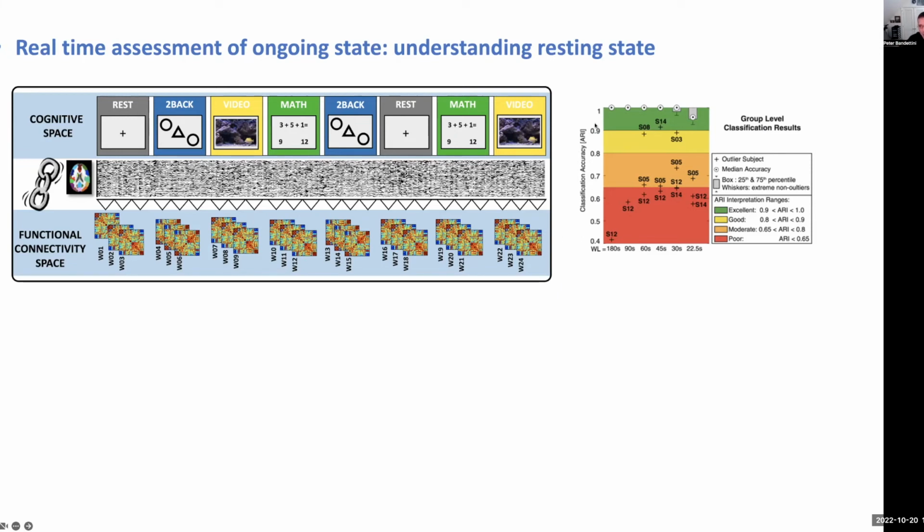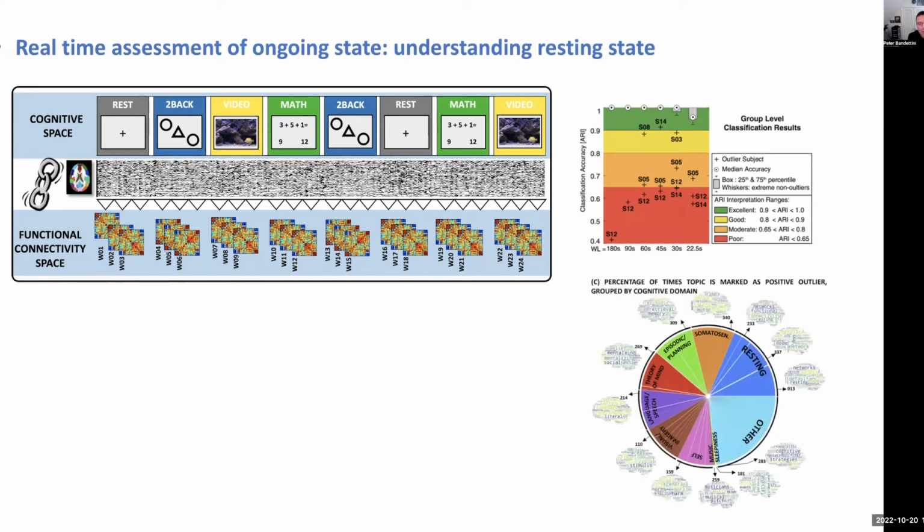And it did it with almost 100% accuracy. And then we decided to take it a little bit further, and that is we decided to try, in an unsupervised way, to go beyond simply identifying which of the 4 tasks are going on. We tried to group the time series into sections where there's a uniform matrix.